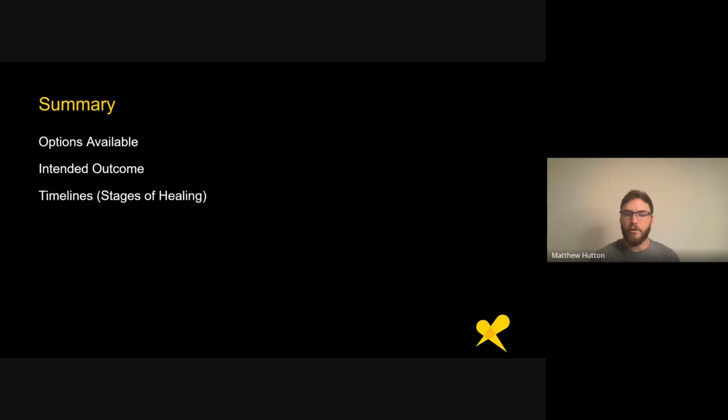The other thing to consider is the timelines, the different stages of healing, the pre-practice versus post-practice, the duration of the effect. I didn't touch on this, but I will now. STIM, probably the effects only last, like I said, 40 minutes. So if you're going to do it after training or after practice, what's the point? You get a 40-minute pain-free window, and then pain's back for the rest of the day.